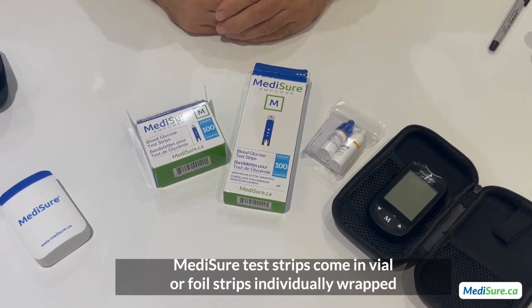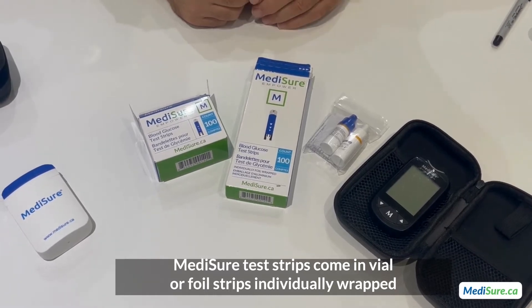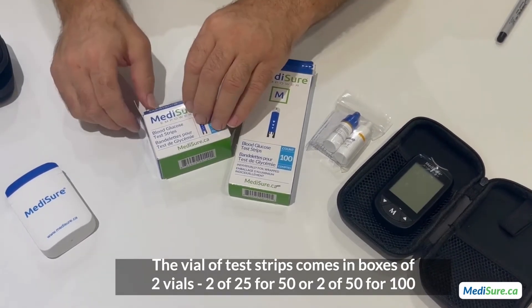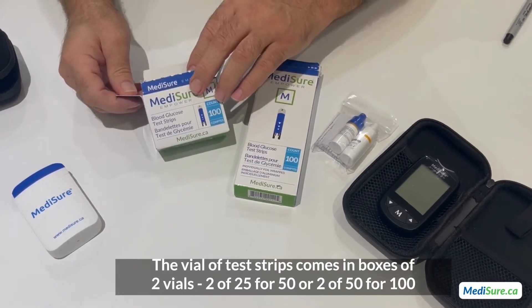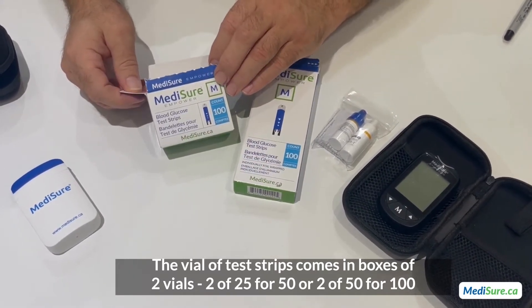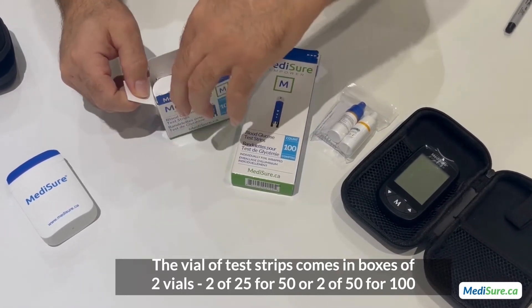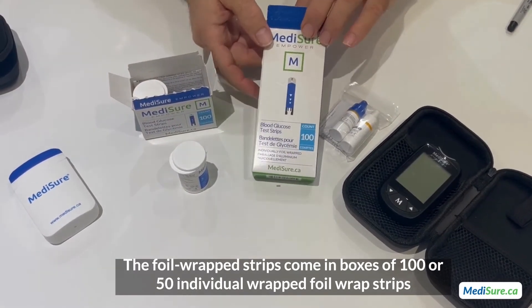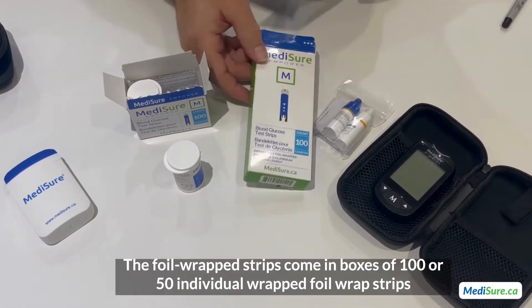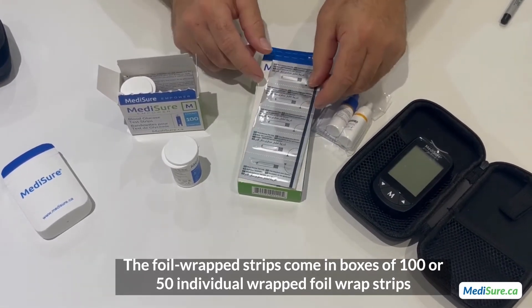The MediSure test strips come in vials or individually foil-wrapped strips. The vials of test strips come in boxes of two vials — either two vials of 25 for 50, or two vials of 50 for 100. The foil-wrapped strips come in boxes of 100 or 50 individually wrapped foil strips.